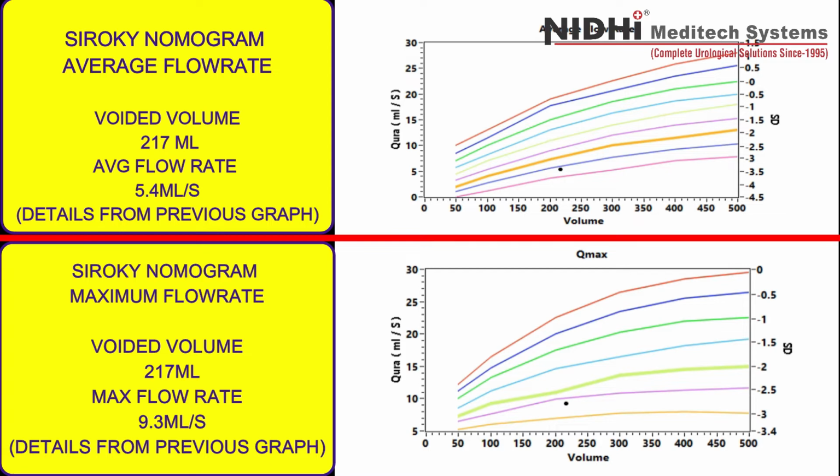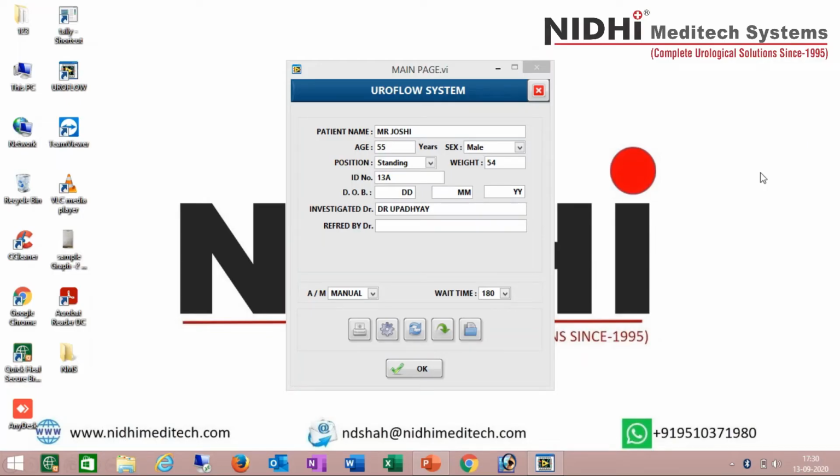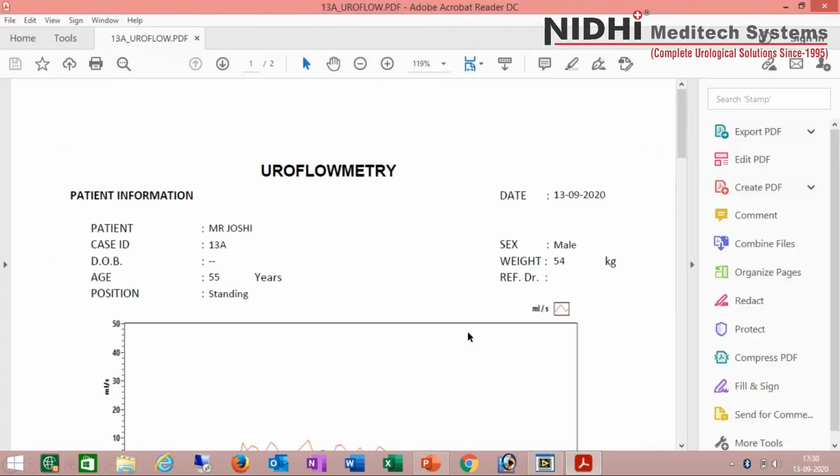With this, we have finished the demonstration of the data processing and analysis part. Now let's see the different features provided by NidhiFlow 8130. This button will help you see the immediate last graph generated by NidhiFlow 8130.